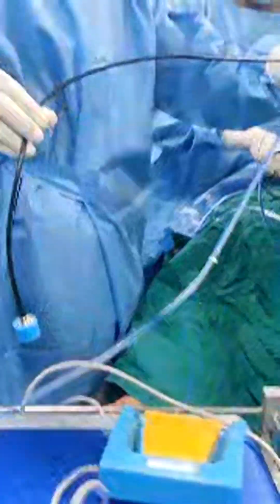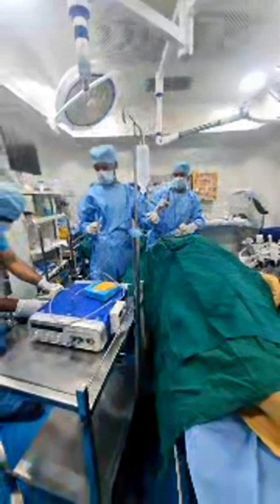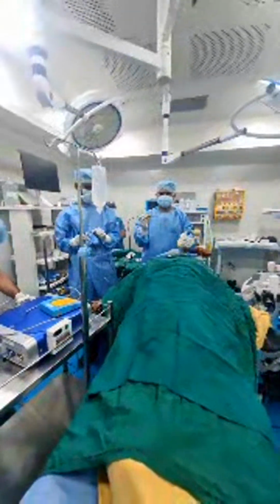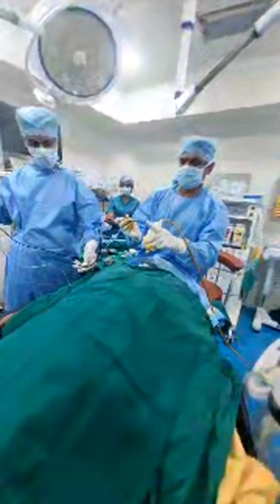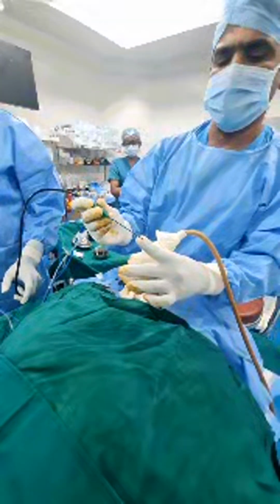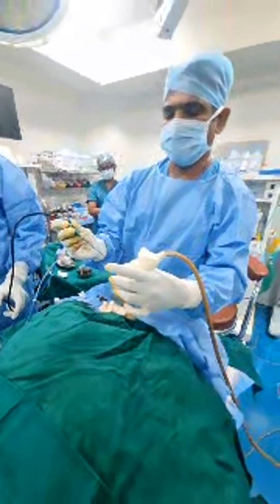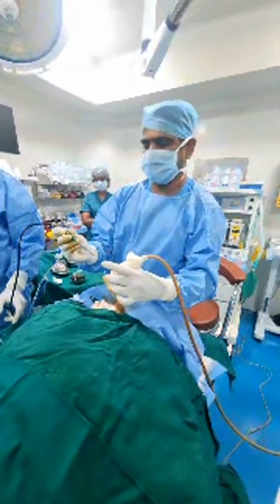So this microwave probe will have a connector for the electricity, and some cold saline also will be circulated. And this is a tube. This is the needle of a microwave. You can appreciate that heat generation will be at the 5 mm tip. That will be distributed all around, usually up to 1 centimeter around, so that the tissues will get destroyed. So that is the precision.